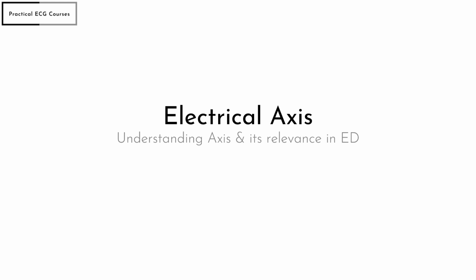So the topic for today is electrical axis, understanding axis and its relevance in ED. There are a couple of reasons for selecting this topic for today. First and foremost, I've had a lot of requests for this topic. A lot of doctors are able to calculate axis, but they do not understand what axis really is, and so they do not use it much when interpreting ECGs.